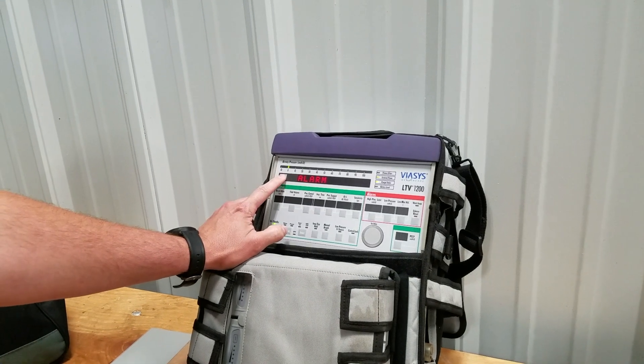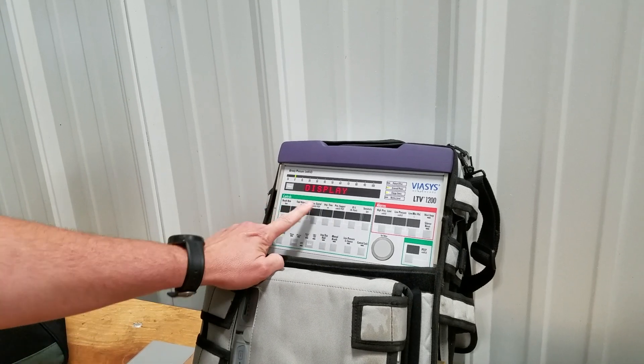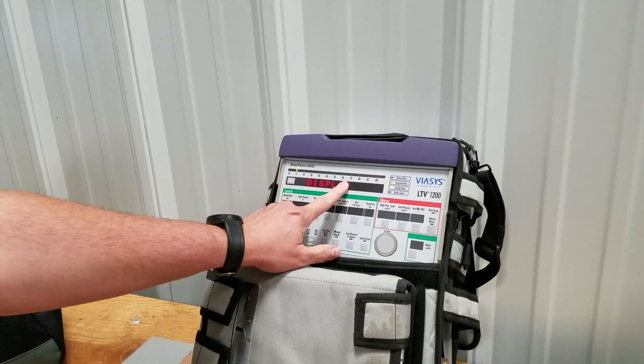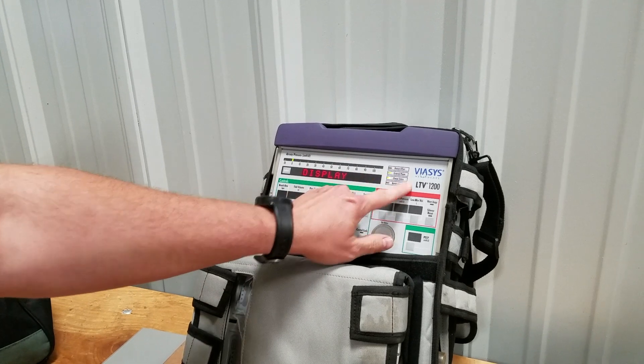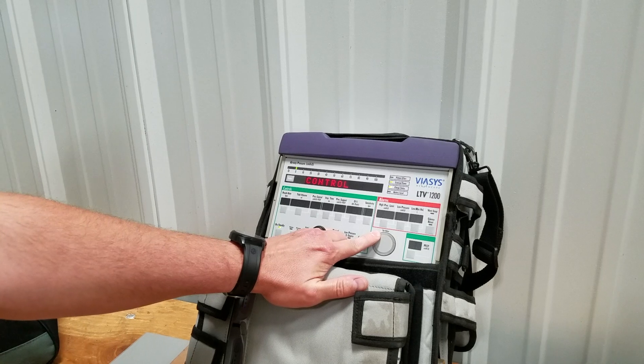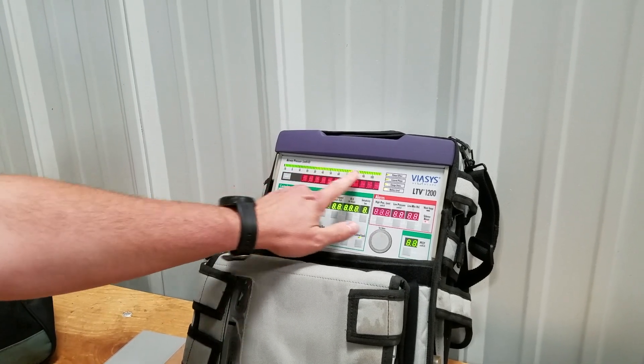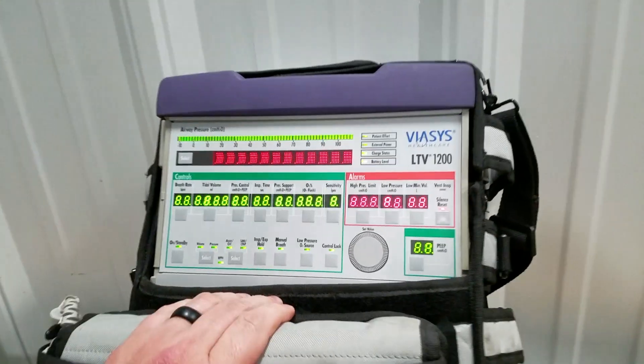We press it again and it stops. Now it's showing 'display,' so with the display function every light on here should light up. We press select and you can see all the lights are lit up and illuminated as they should be.